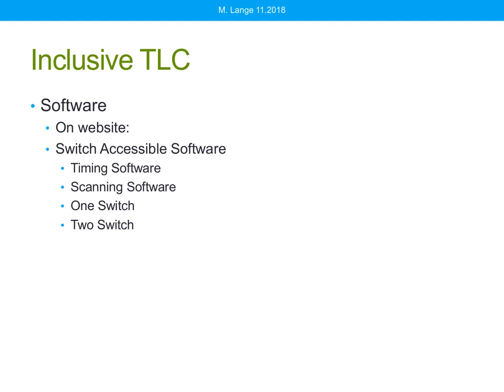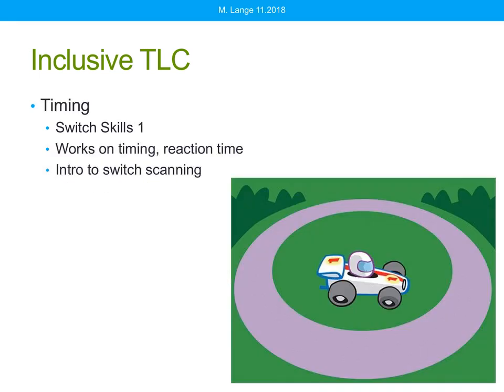Inclusive TLC has a number of options. On their website, if you go under their category of switch accessible software, you'll see some subcategories: timing software, scanning software, one switch, and two switch. All of this software can be used to help build switch skills.